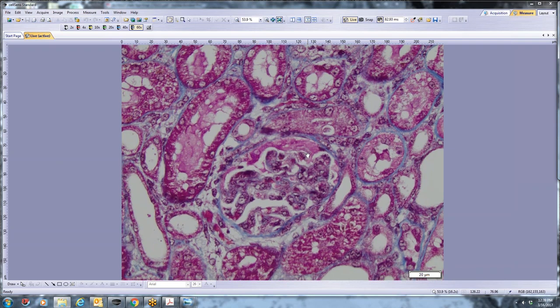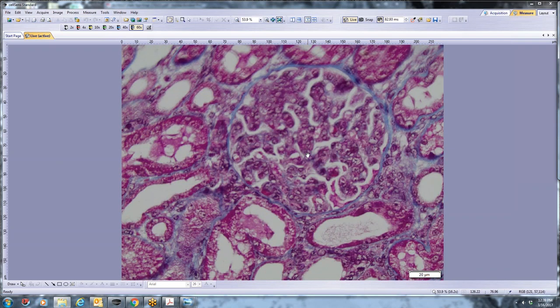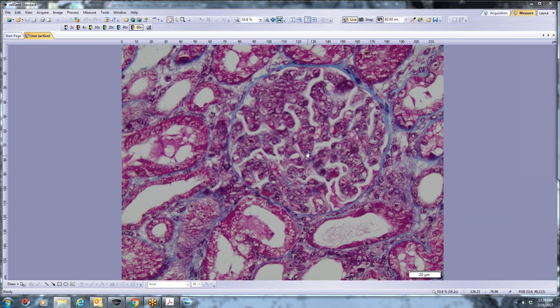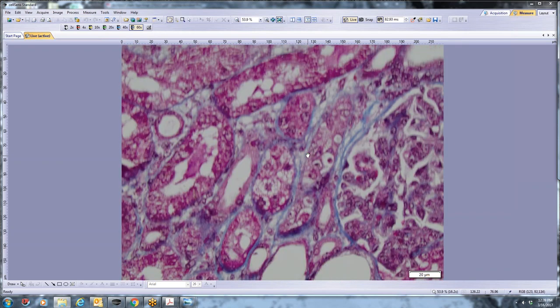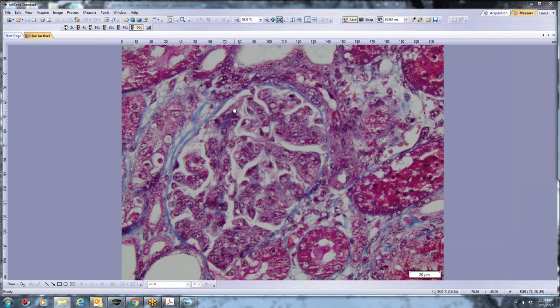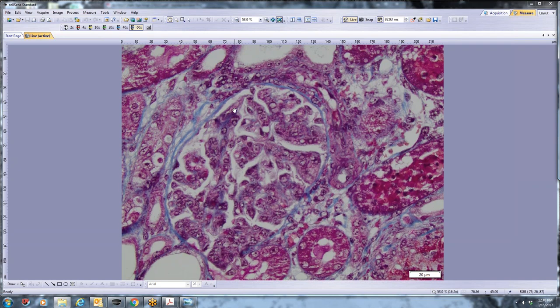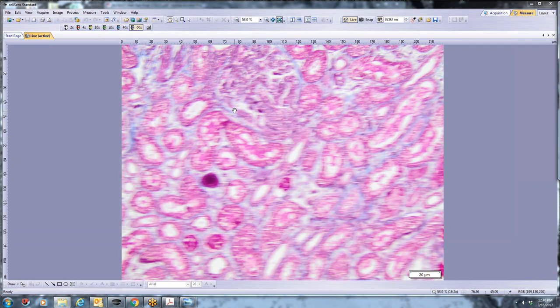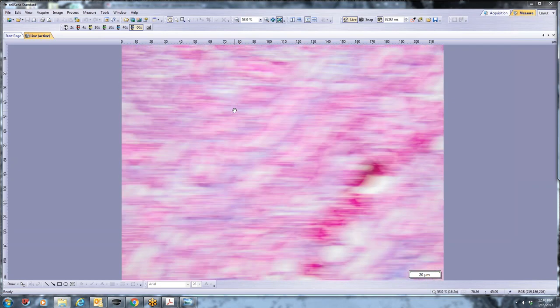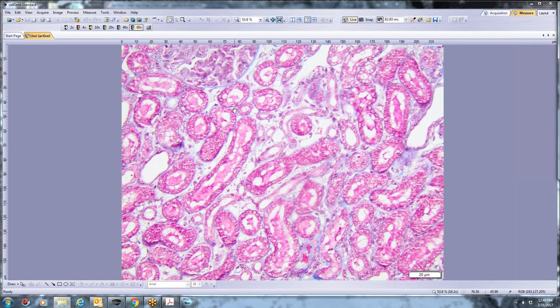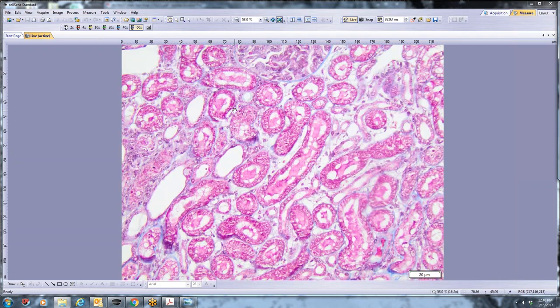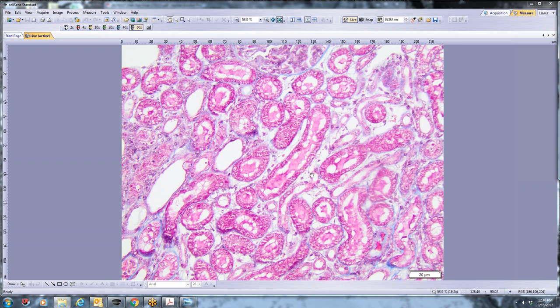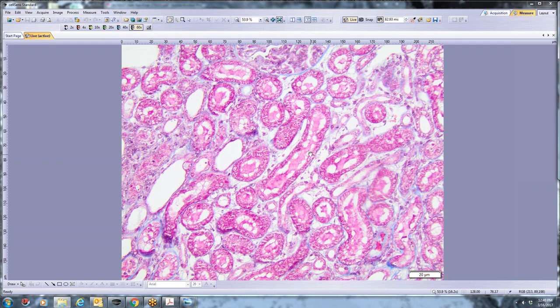This particular stain is of interest because we start to see a little bit of material in Bowman Space. Again, the hypercellularity is quite prominent. The material out here might be indicative of a previous capillary rupture. So that might be how we're getting a little bit of those red cell casts. So it's a little bit of fibrinoid necrosis of the glomerular tuft. And then overall, the actual interstitial fibrosis is quite minimal. This looks like an acute injury to the tubular interstitium.